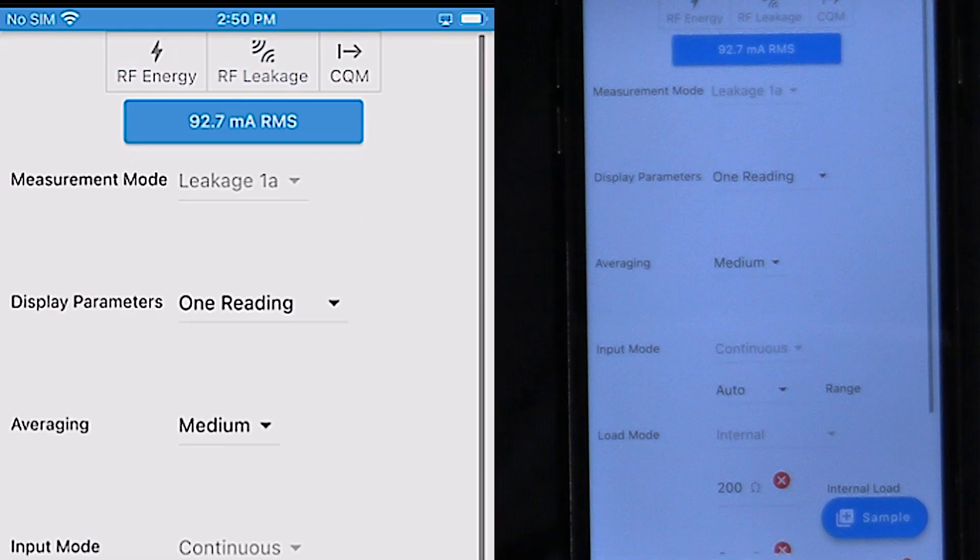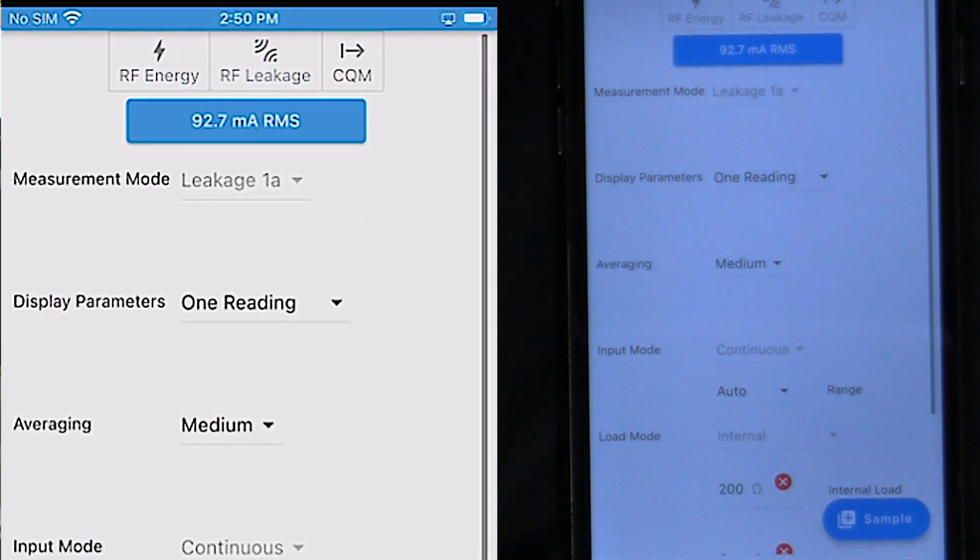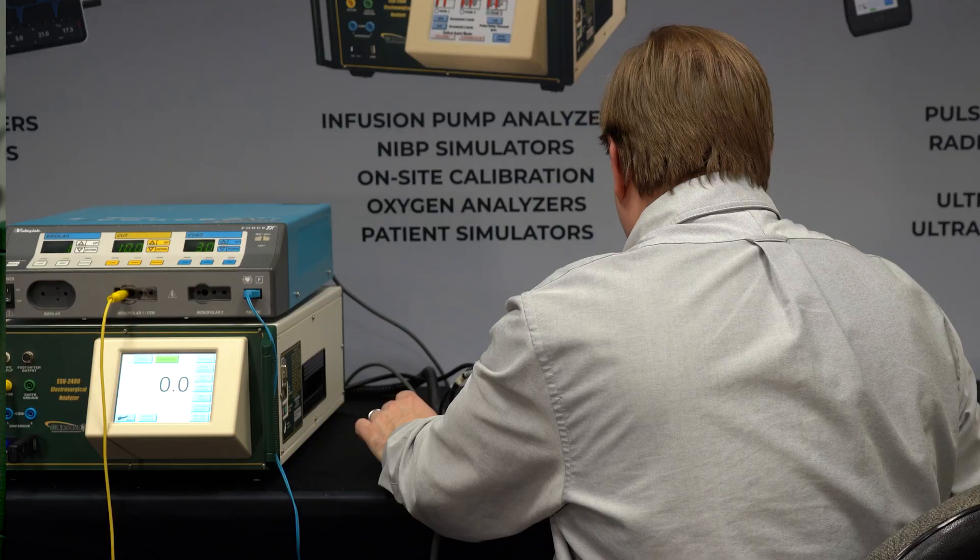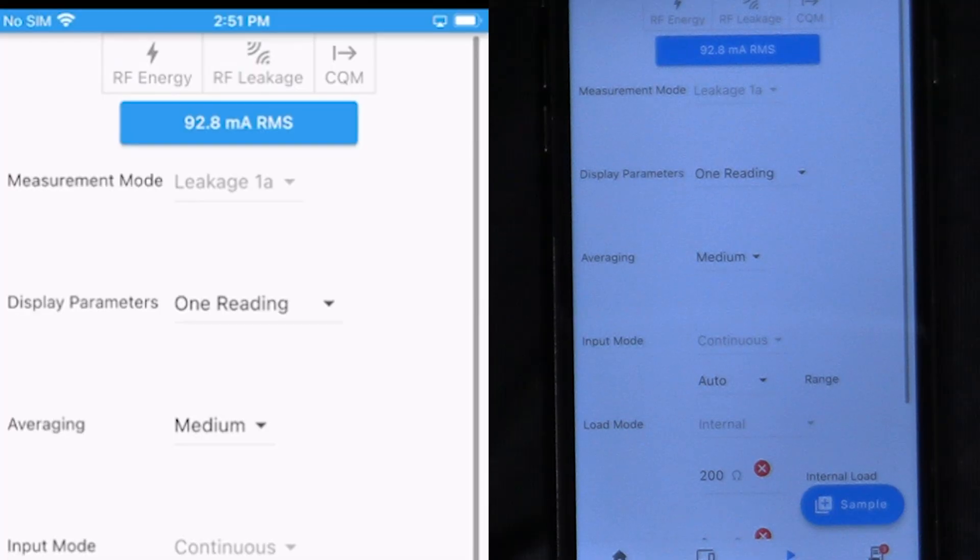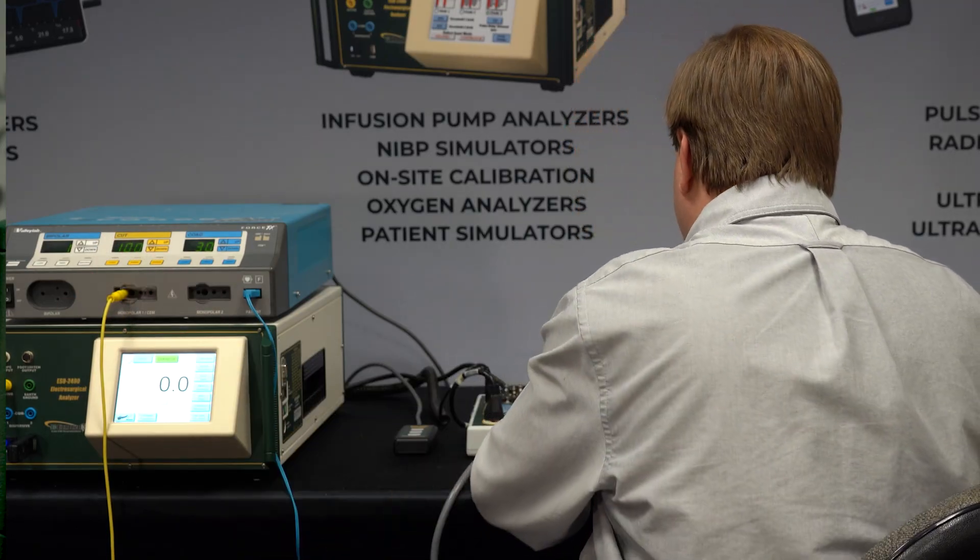I can measure the output of the generator. This is our leakage. We're measuring from the active port to earth ground. I can press sample and that gives me my reading on the MyBC Mobile. Now we can continue on to do any of the other ports. We could test monopolar 2, we can test bipolar and all of the various leakage modes.